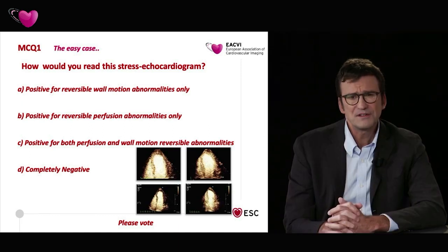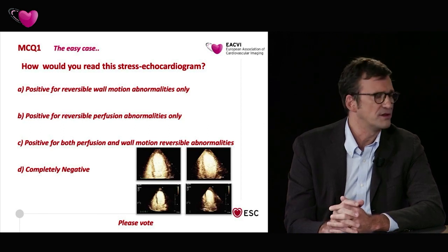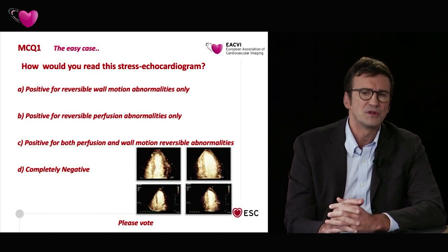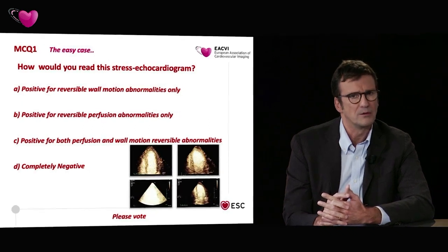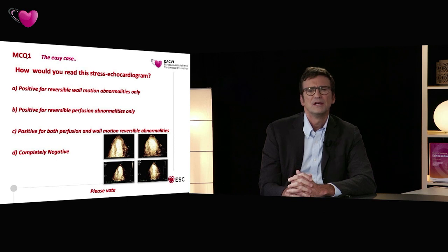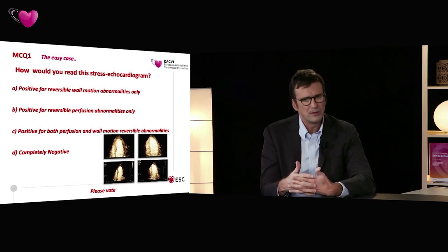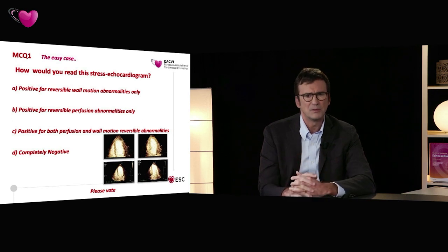Yes. First of all, for people not practicing contrast, the first important thing to know is that when you image with contrast, you need to lower your mechanical index down to 0.1 or something around, so that you can avoid breaking the microbubbles while still gaining good imaging. Real-time imaging or trigger, as you want.